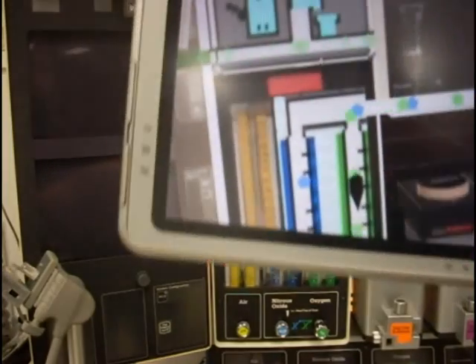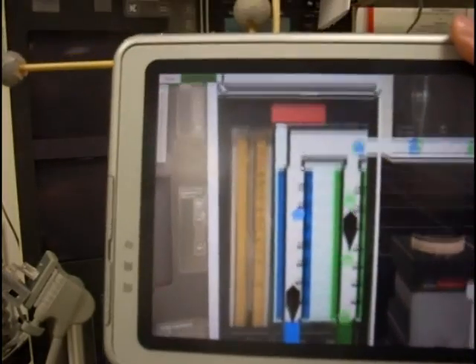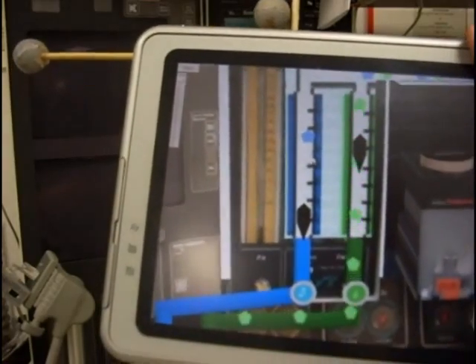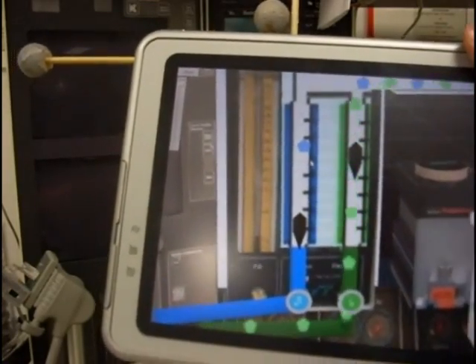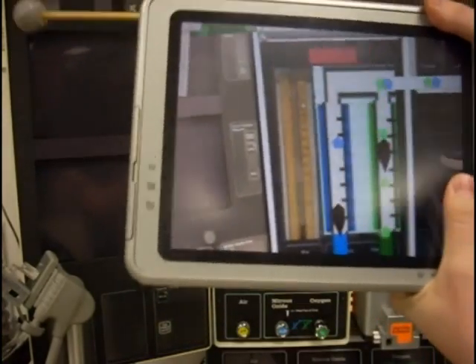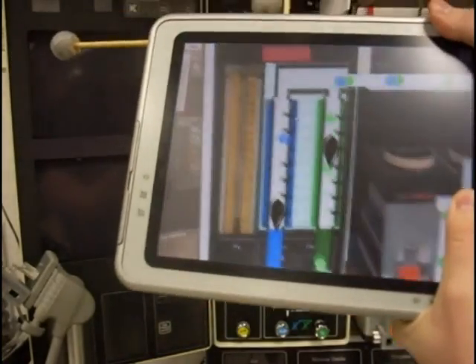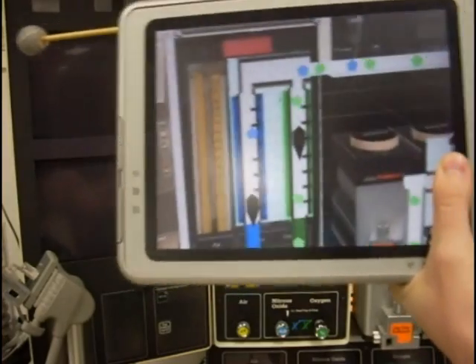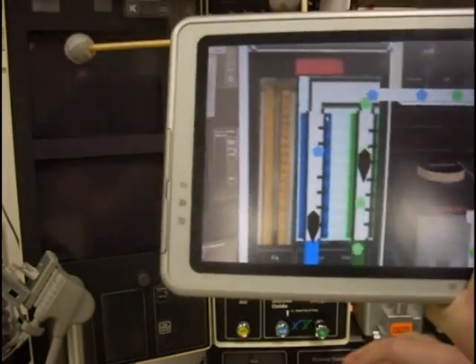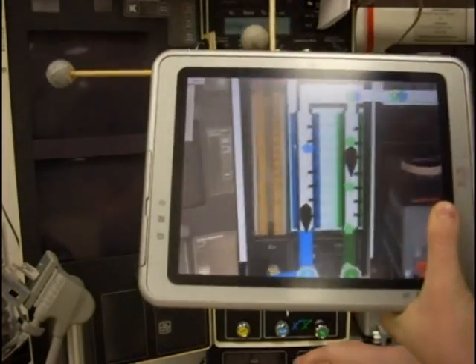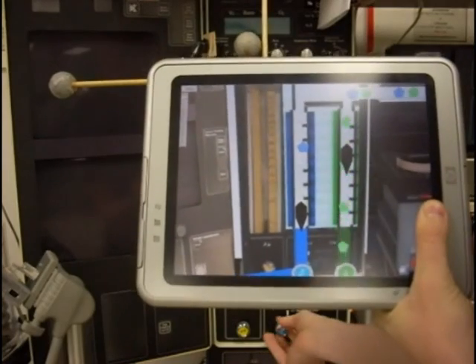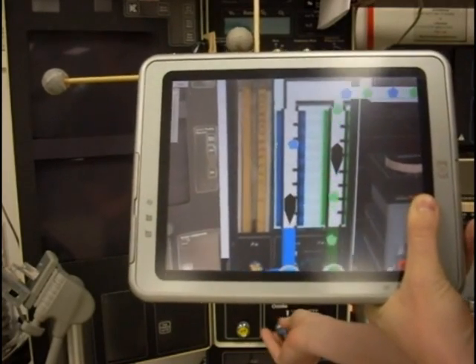The flow meters control the flow of oxygen and nitrous oxide. In this example, the user turns the nitrous oxide knob, which visually increases the flow of the blue particles that represent the nitrous oxide.